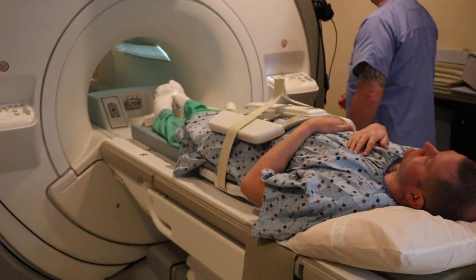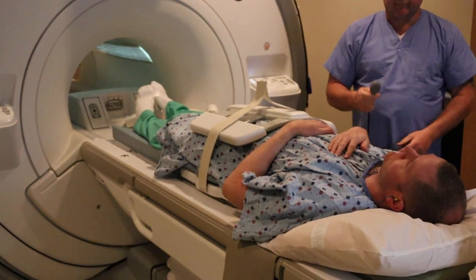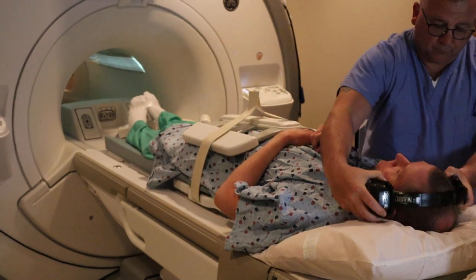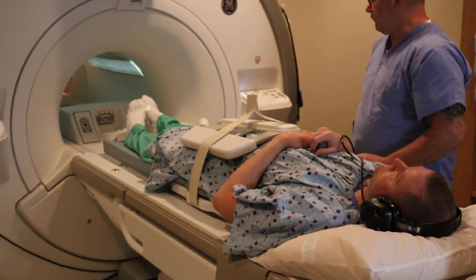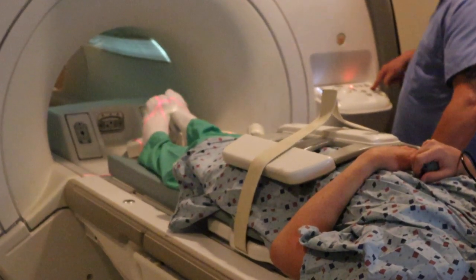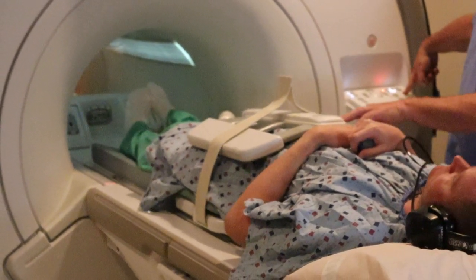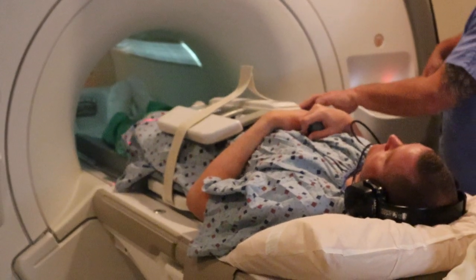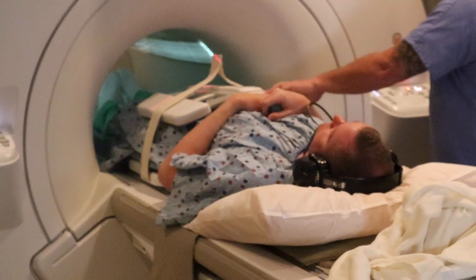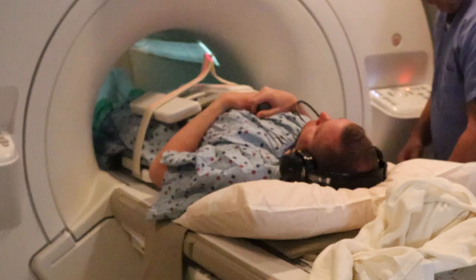If the anterior piece is too high or too low, you're not going to have matching signal. Provide the panic ball to the patient to communicate with the technologist, and provide music if offered by the imaging center. You now advance to scan, aligning dead center on the coil. Lock in your landmark and advance to scan.